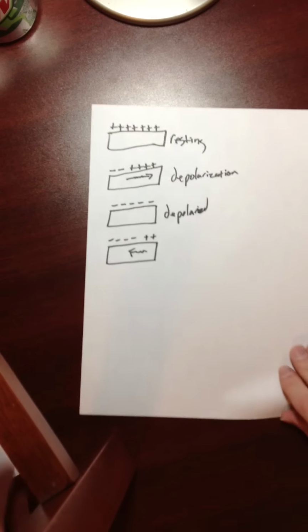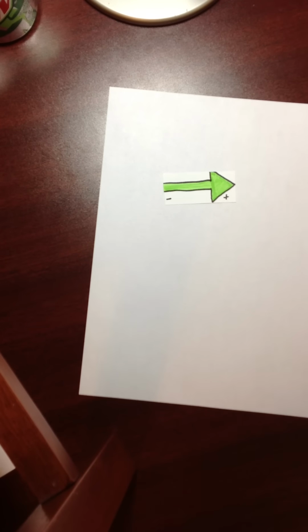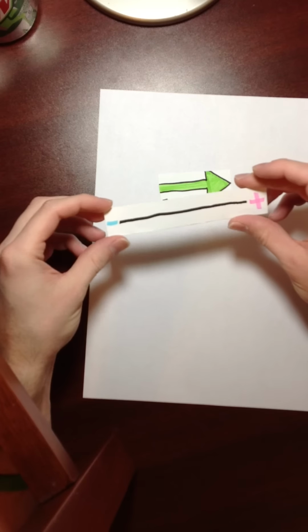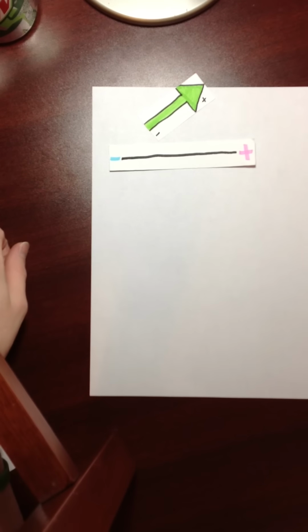Okay. So, the next thing to look at is how this vector, this movement of current, if you will, relates to leads and how we're going to view this. So here's my arrow indicating our movement of current from negative to positive. Now here's a lead here, and this is what I'm going to use. Now we've seen a lot of where a lead is like this, and then we'd have something like this, and he would say, well, is this positive or negative? And we're like, wait, what are we talking about again?